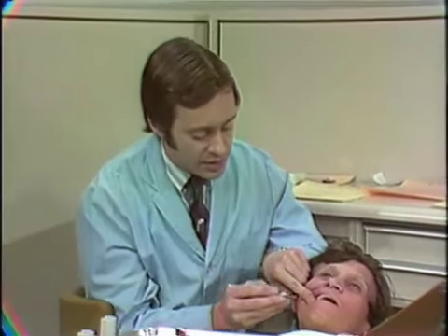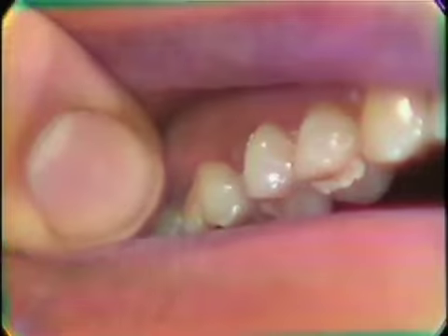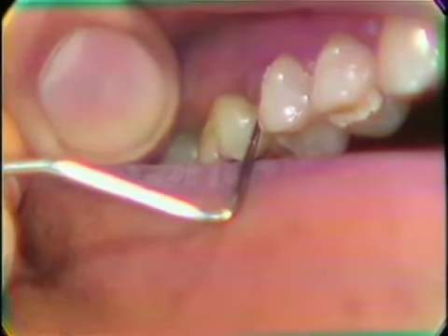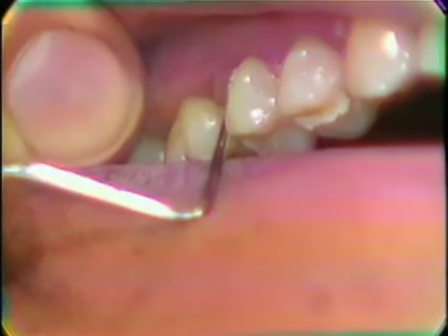In measuring pocket depths, I would like to have you angle the probe toward the apices of the tooth. And I'd like you to come in at an angle approximately like so, until you encounter the depth of the pocket.